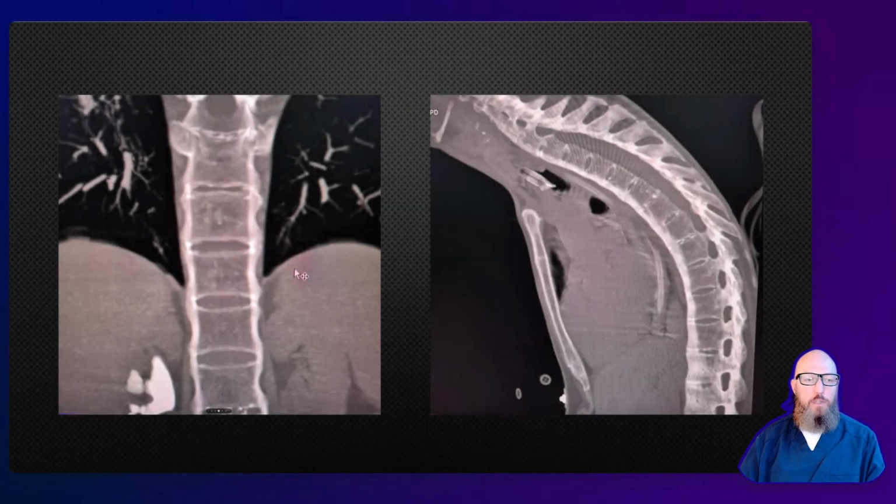All right, these are the pictures of bamboo spine. And so what you get is these osteophytes form on the end plates of the spine. The spine should not look like this, right? There should be space in between each of the vertebral bodies. But this bridging osteophyte formation is what you see, and that really stiffens the spine. It's basically ankylosed, which is where it gets its name, ankylosing spondylitis.